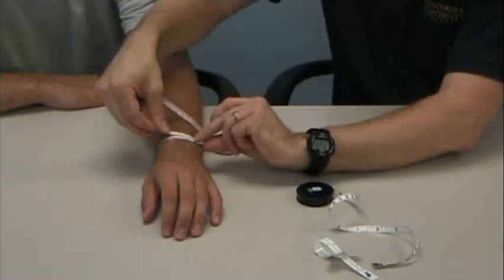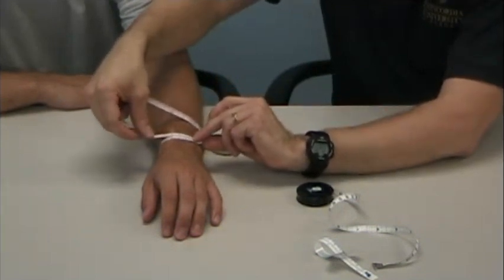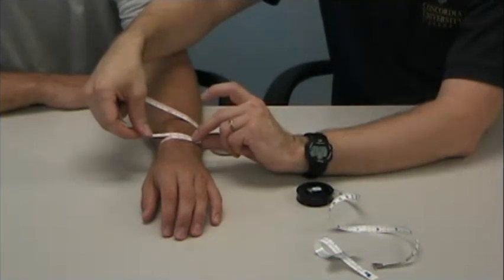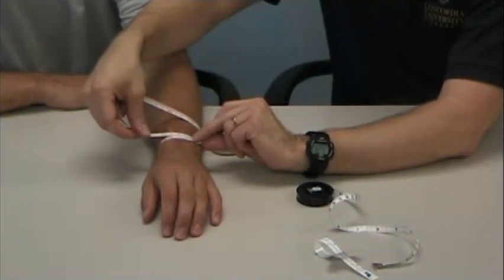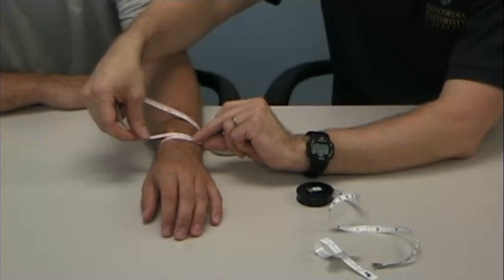So again, measuring basically the same place. I'm actually coming up with a slightly different measurement here, about 16.9 centimeters circumference there.